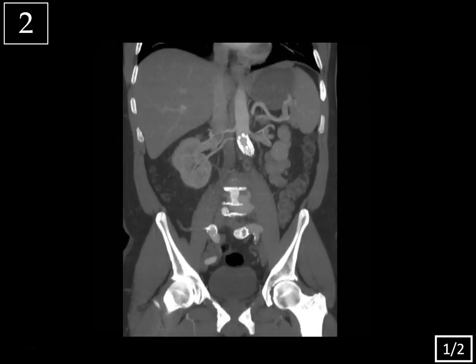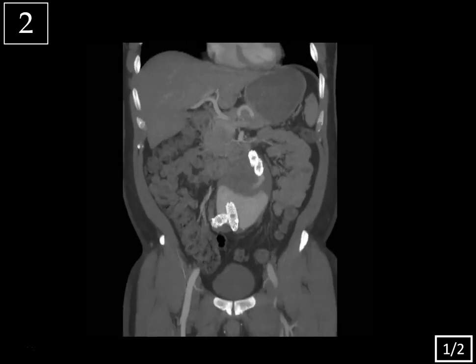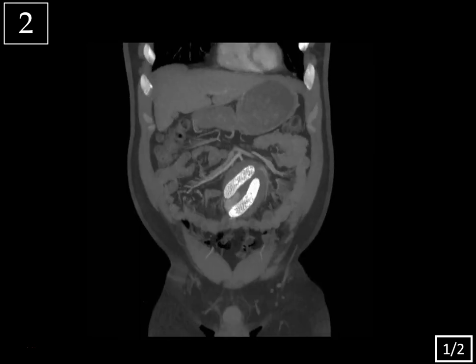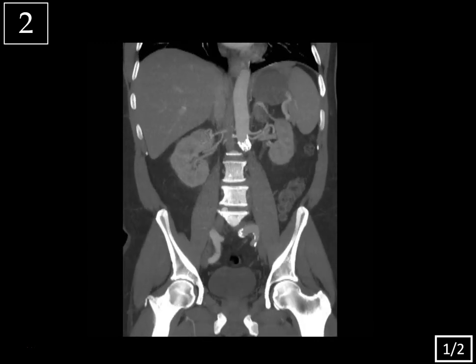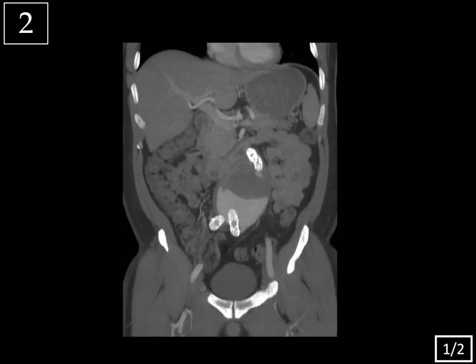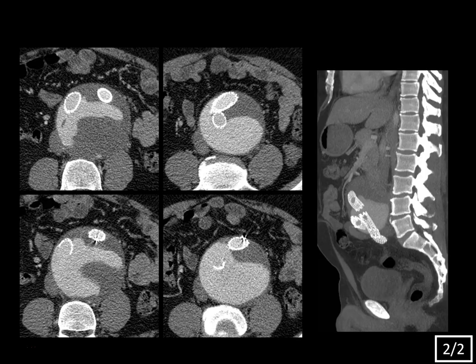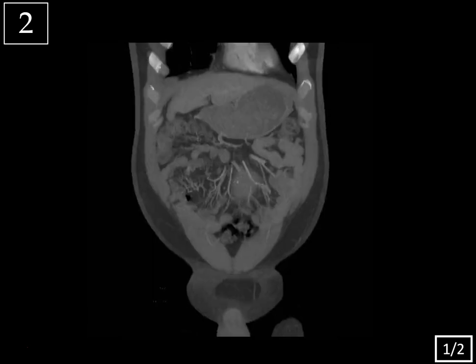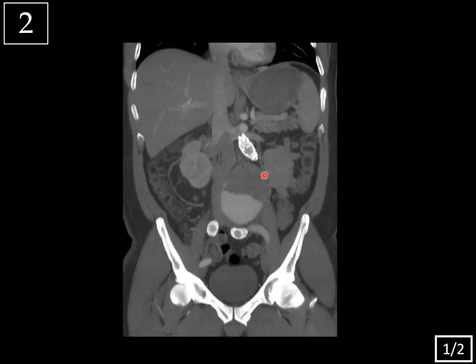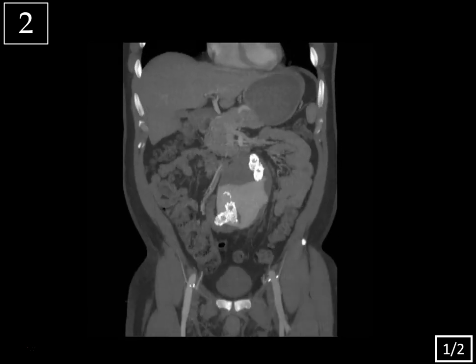Next case: coronal CT angiogram, abdomen and pelvis, cine clip. Looking at this coronal cine clip, you can see that there's a large infrarenal abdominal aortic aneurysm, and we also have an aortic endograft — so there's been an endograft repair. But notice that we have contrast within the excluded aneurysm sac here. This should not be here; we should just see non-opacification of the sac.